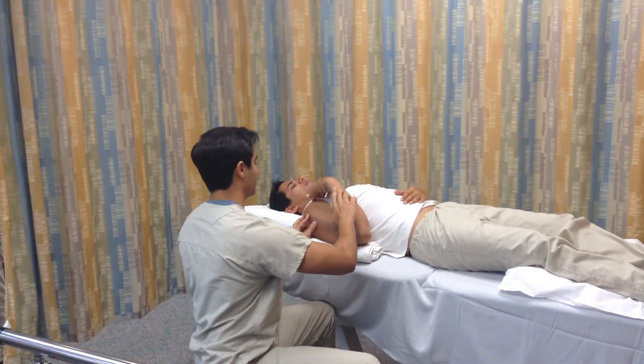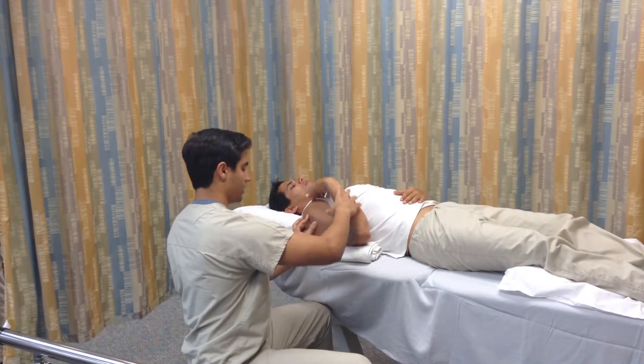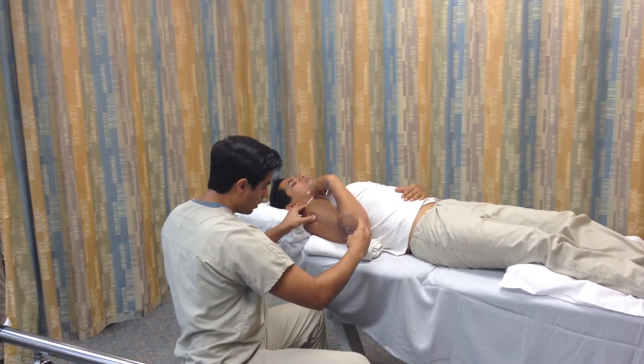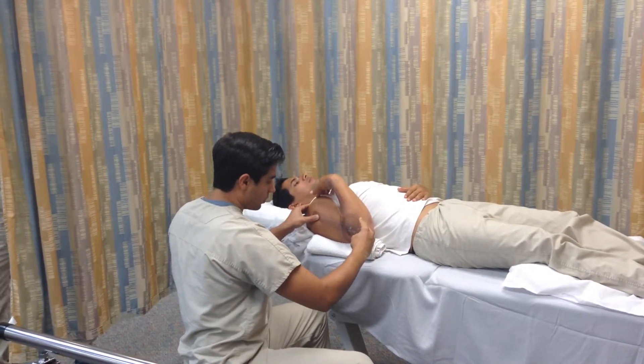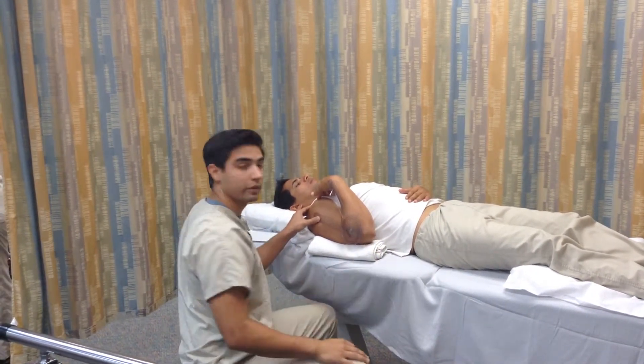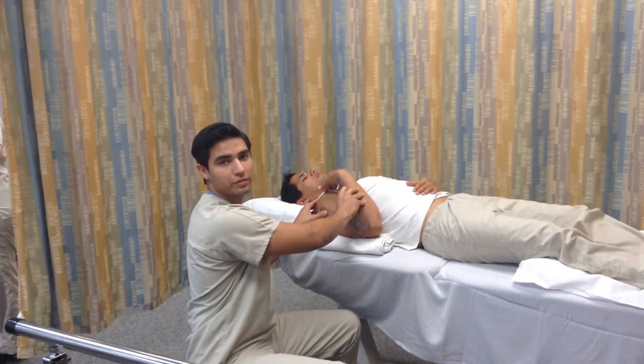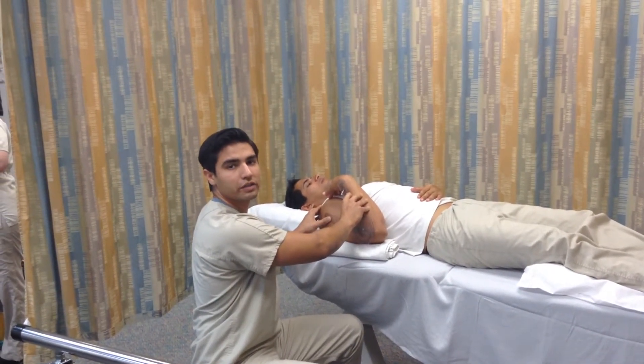The proximal arm at the same landmark, and the distal arm at the same landmark. We have about 140 degrees, and we'll read and record that. And that's the measurement of range of motion for right elbow flexion.